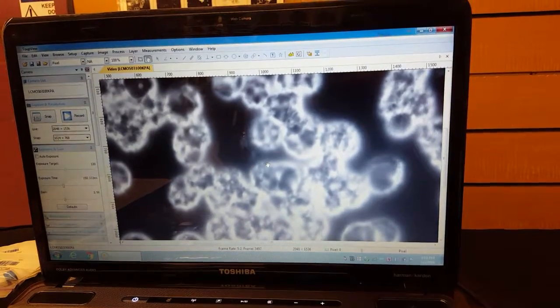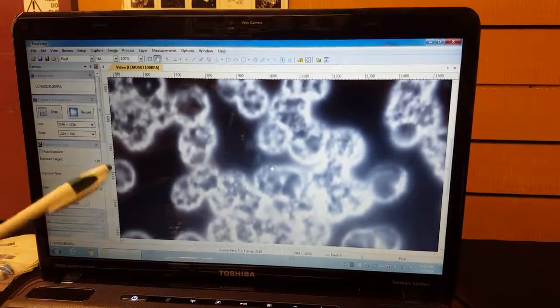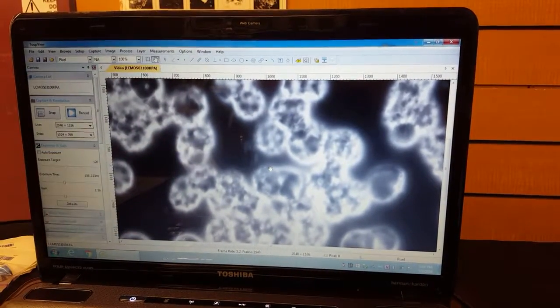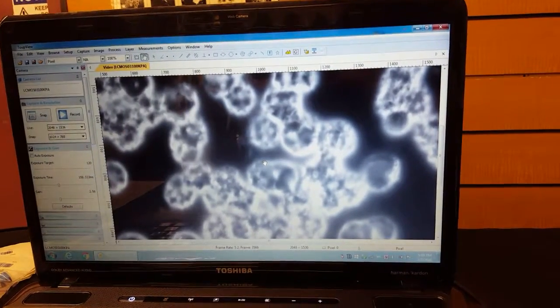So look, your cells are good, but why you don't want them clumped is because you want your white cells to float around. And they can't float when they're doing that. So your immune system can get a little weak.